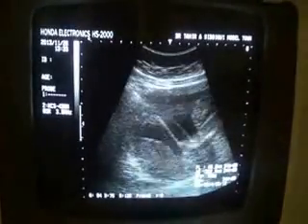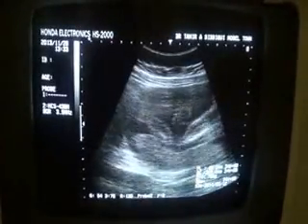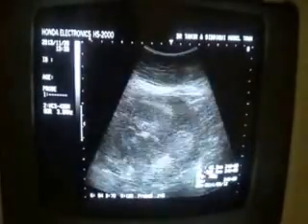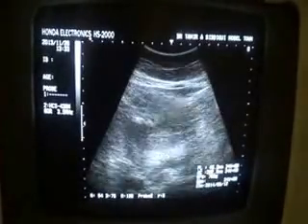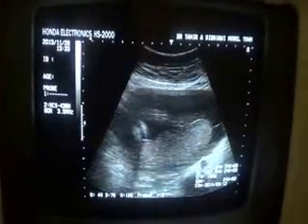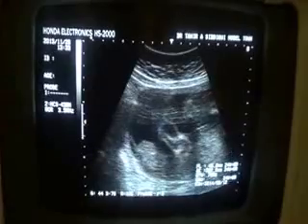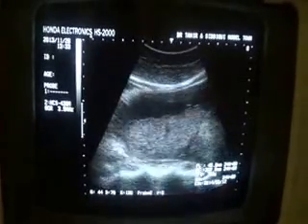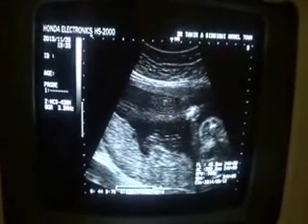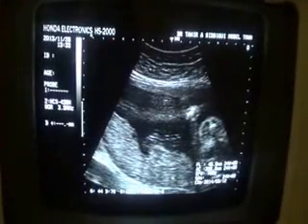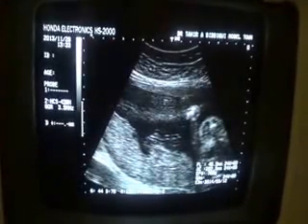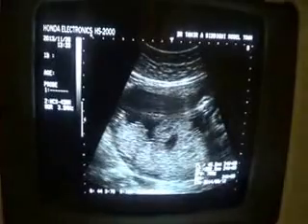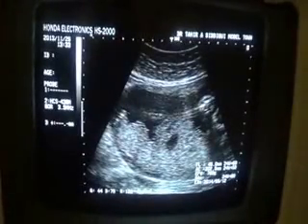This is fetus number two. You are seeing the posterior placenta. This is the placenta — these are placental areas visible in this segment.